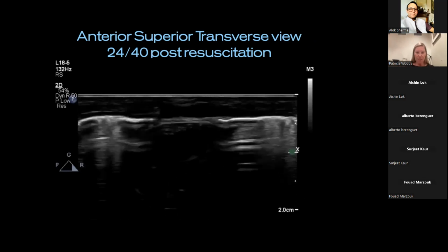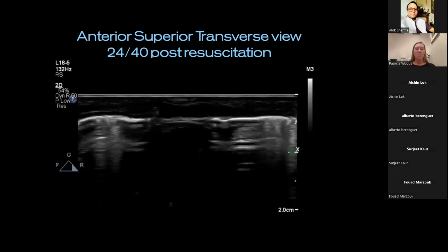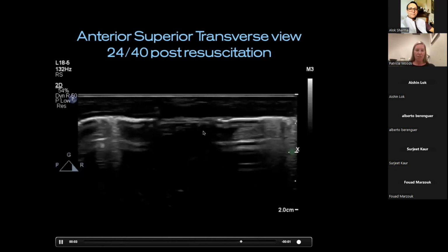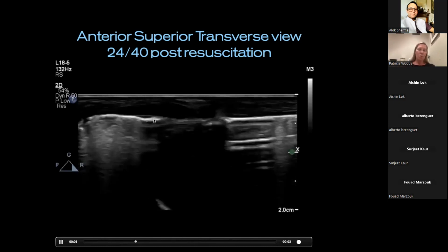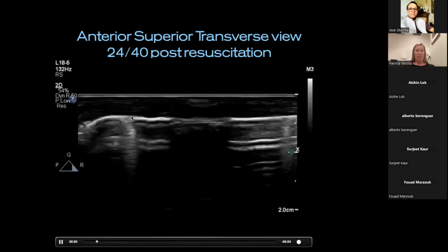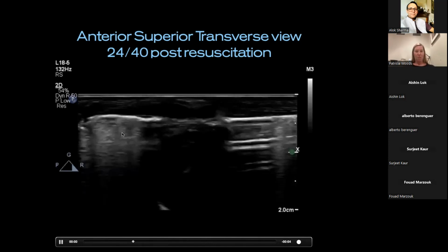All right, I apologize. This one is a little bit dark. Perhaps it's undergained, but look, this is a beautiful transverse superior view. So I love this because you can see the sternum centrally, and you can compare right to left in one shot. Here, centrally, I've got the thymus and cardiac activity all dark beating away here. And I'm comparing the quality and nature of the pleural line from the right superior transverse to the left. And I'm looking, hopefully with you, that looks defined. It's shuddering away over here. There's some A line presence and there's B line presence. So that's kind of fitting.